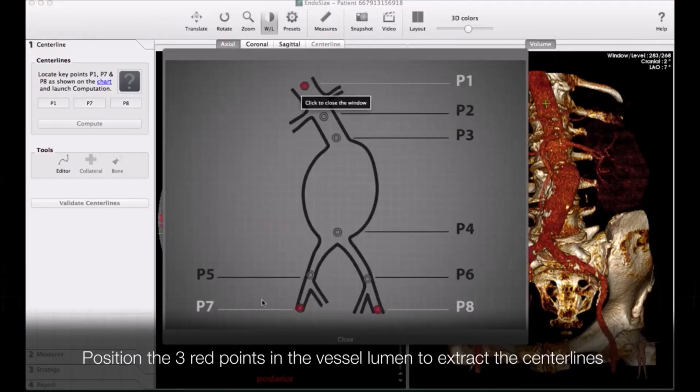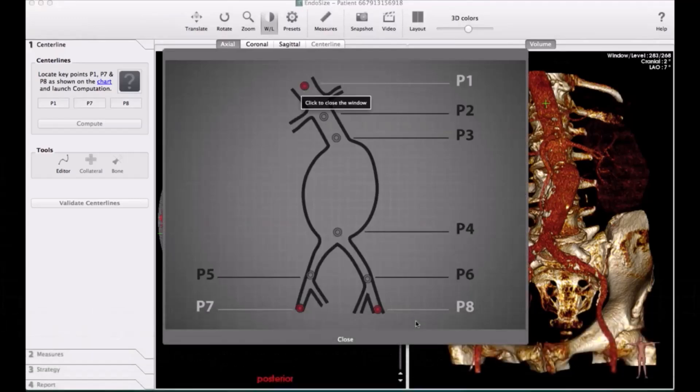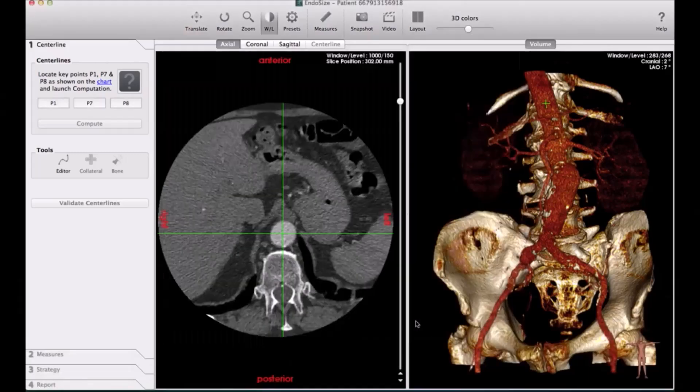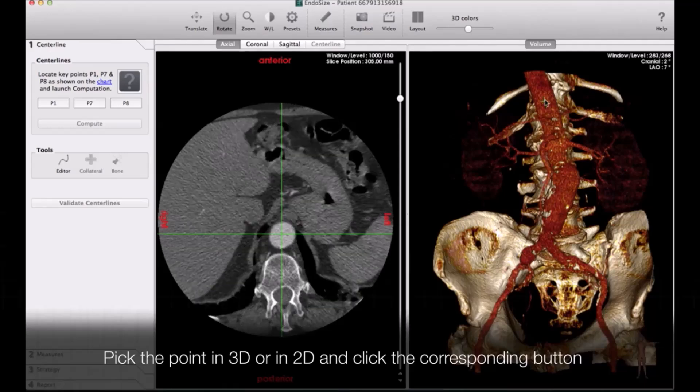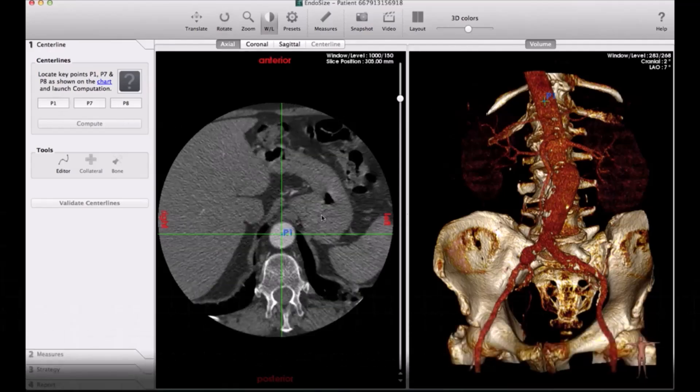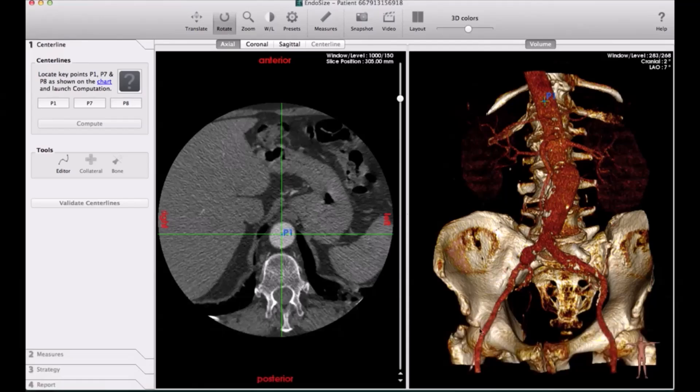You can see the diagram for the point P1, renal, P2, bilateral, and P7, P8, right and left common femoral artery. It will automatically do the measurements for you.